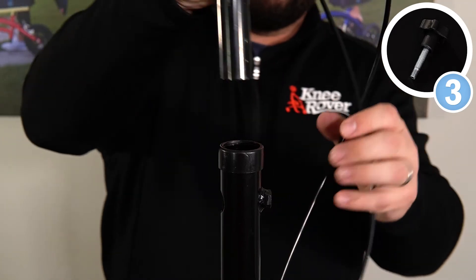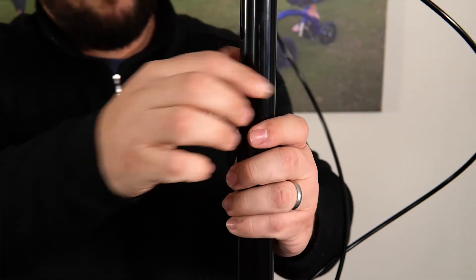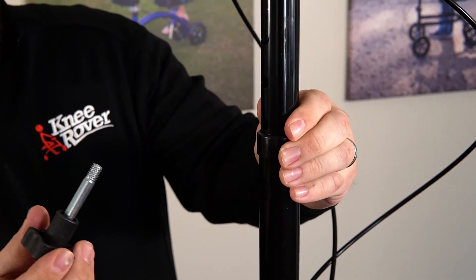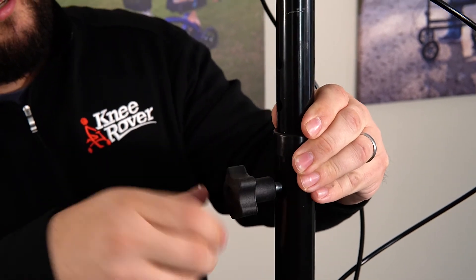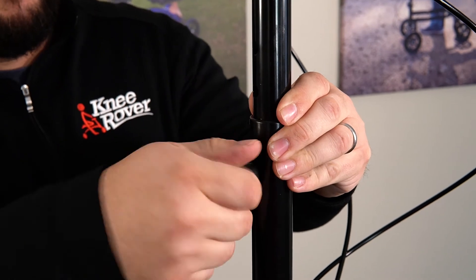Step number three, we're going to take the handlebars and drop them into the steering collar at your desired height. You're going to take your height adjustment knob and just drop it into this hole here, and then screw it all the way in until it's tight.